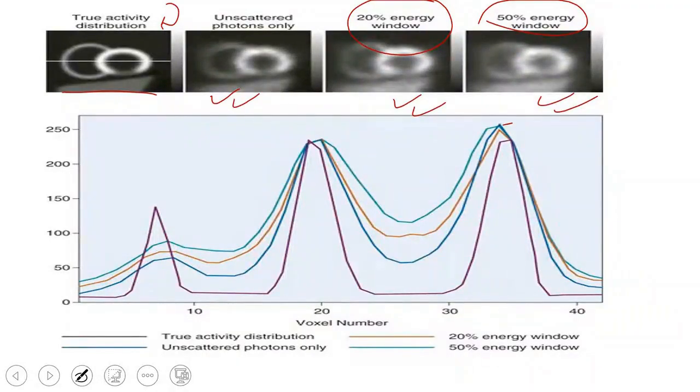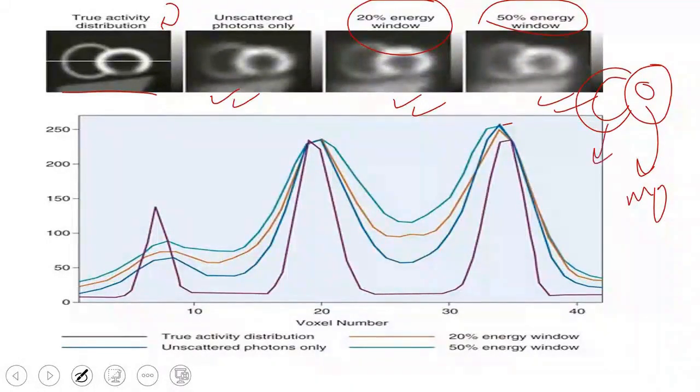The more you widen it, the harder it is to differentiate the myocardium, the white circular part, and those two circular rings. You have a round part here. This is the myocardium. This phantom I created looks like the heart muscle. The first round part is the myocardium, and the second ring resembles the left ventricle, and here is the right ventricle. This is like the same image of the heart that we see when we take a cross-section of the heart.